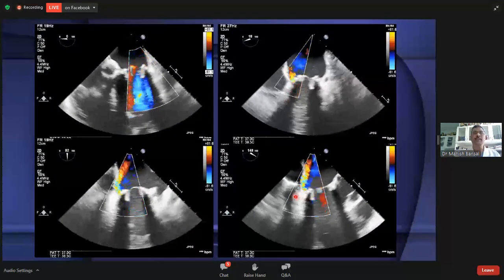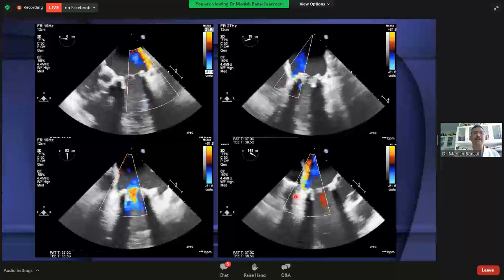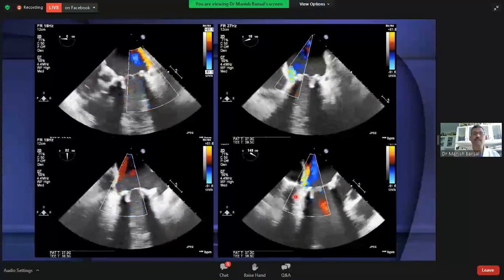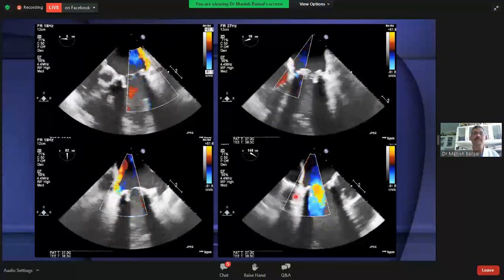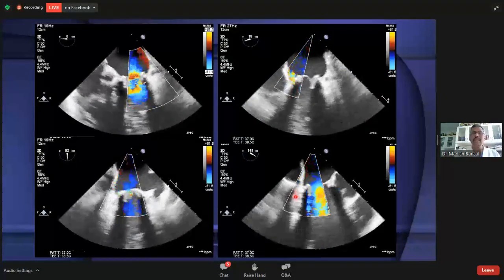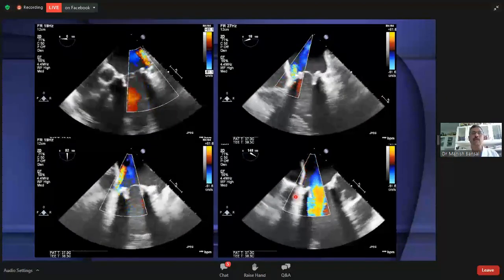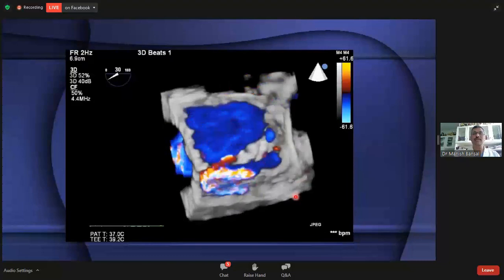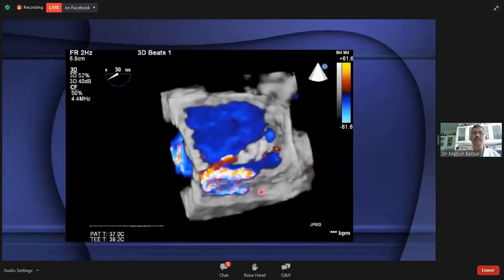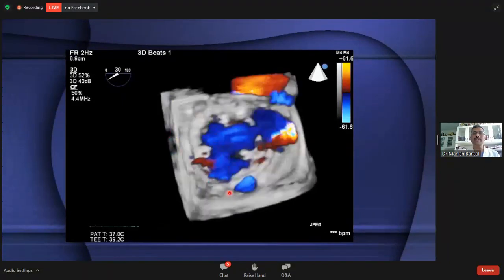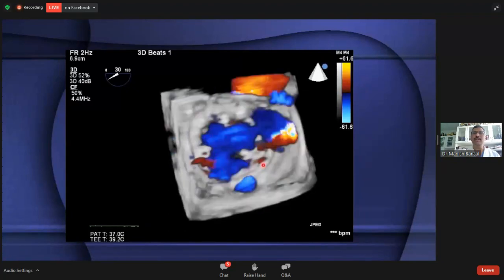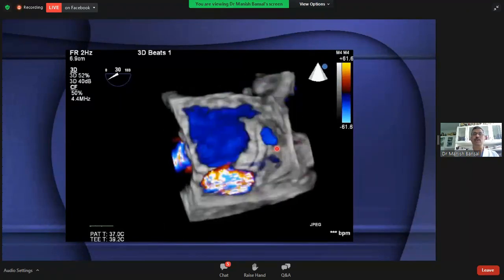In another patient with paravalvular leak around the mitral valve, 2D images again make it difficult to determine the number and location of defects. However, 3D TEE clearly shows that there are two defects: one larger defect in the region of around the six o'clock position, and a smaller defect in the region of two o'clock.